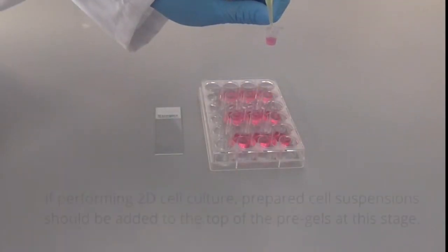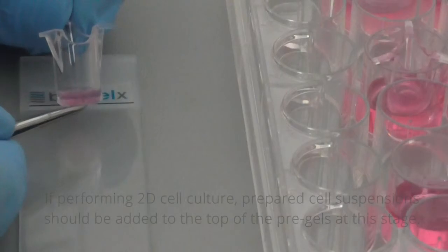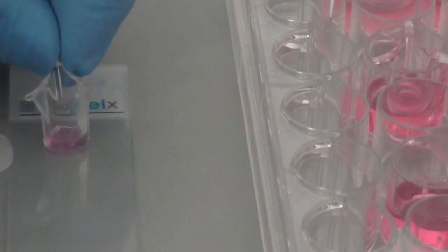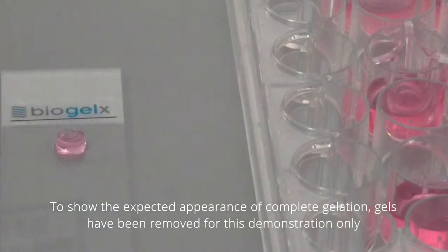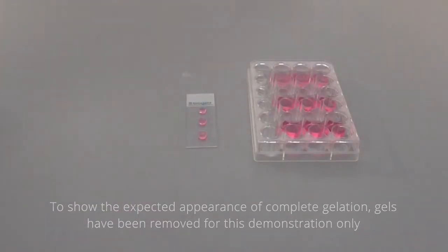After the appropriate incubation period, gently remove the media surrounding the insert and on the surface of the gel. Then replace with the prepared cell suspension for 2D culture or fresh cell media for 3D culture. To show the expected appearance of complete gelation, gels have been removed for this demonstration only.